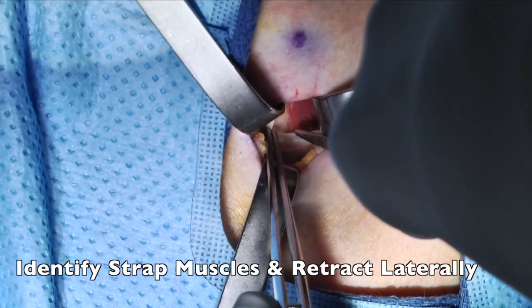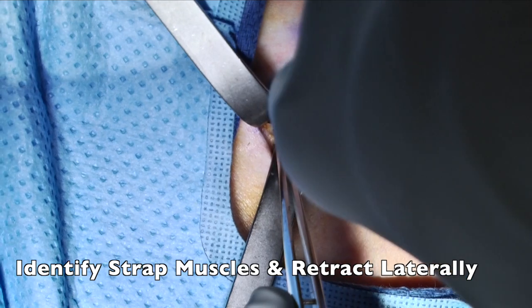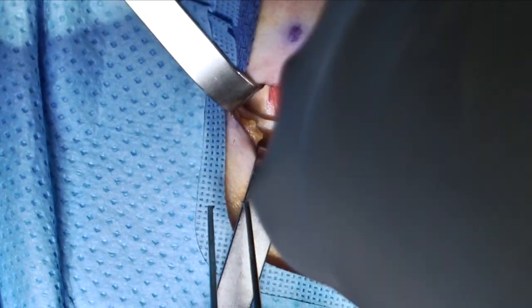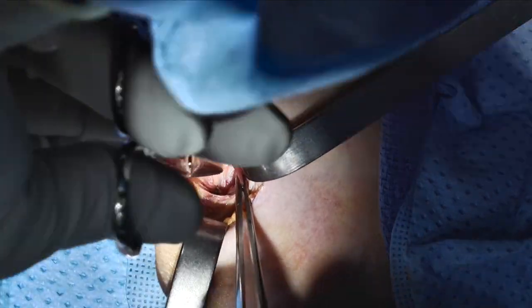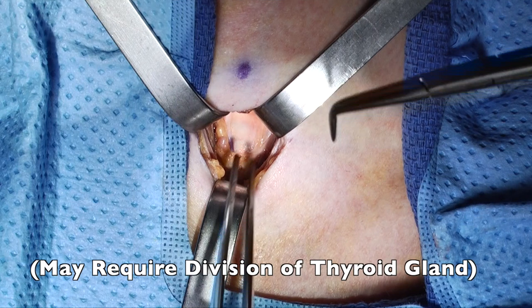Once enough fascia has been cleared away, the strap muscles can be identified. These are undermined, in this case again using Jones scissors, and the retractors are placed beneath the strap muscles in an attempt to clear this tissue away. As the strap muscles are retracted and we approach the airway, often times we will encounter a portion of the thyroid gland. In this case, however, we did not.